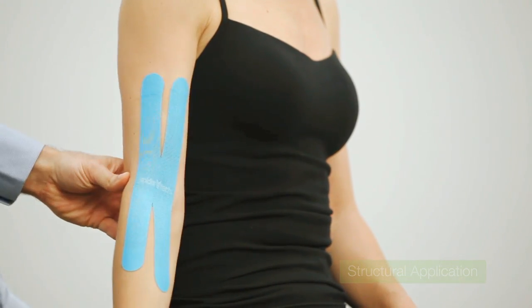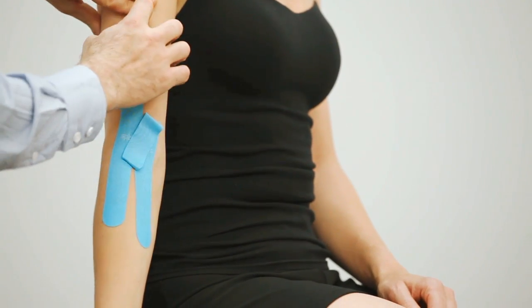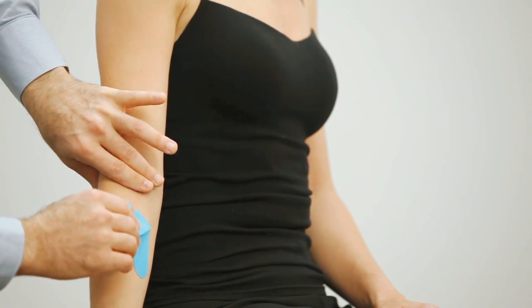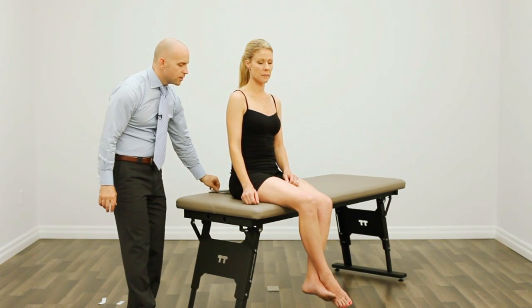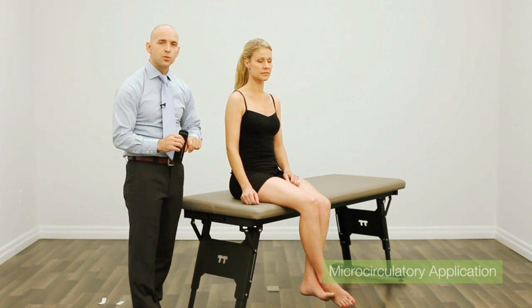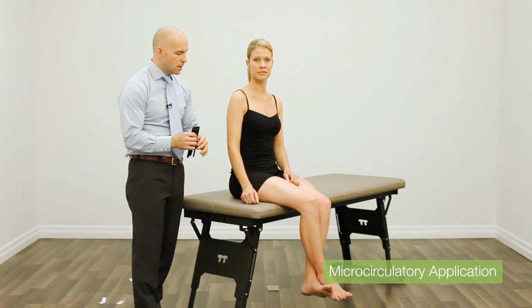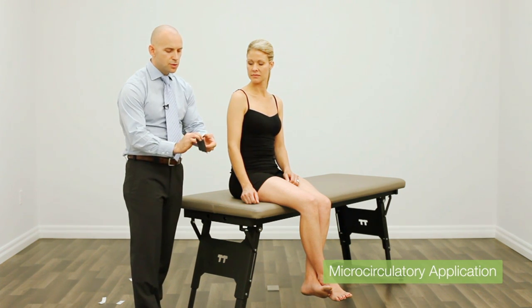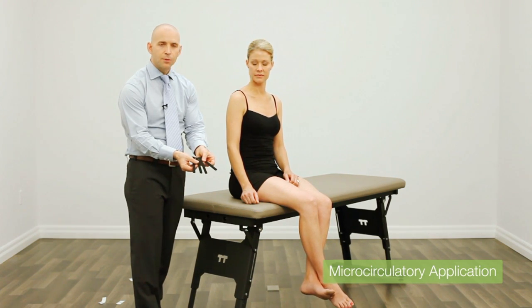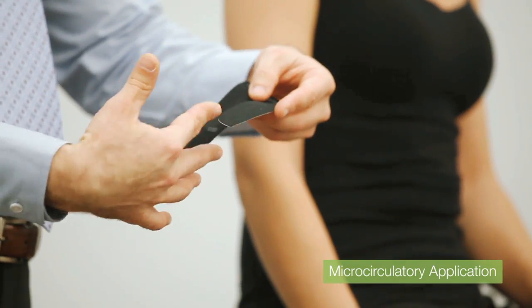We'll remove this application and show you the final category: micro circulatory. For a micro circulatory application, our goals are to treat any type of swelling, bruising, edema, and lymphedema. With micro circulatory applications, you use a very specialized application — in this case a pre-cut lymphatic application, or you can take a roll and cut the pieces individually.